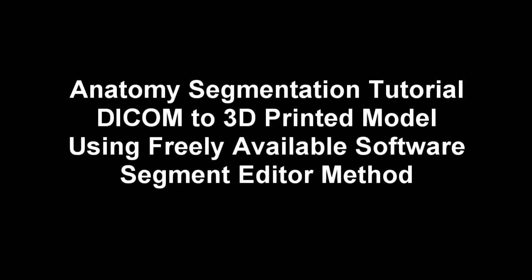This tutorial uses free open source software, namely 3DSlicer, MeshMixer, and Cura to prepare the 3D models. In this tutorial I'll be using a newer method that's been developed within 3DSlicer to segment anatomy, and that is with the segment editor.